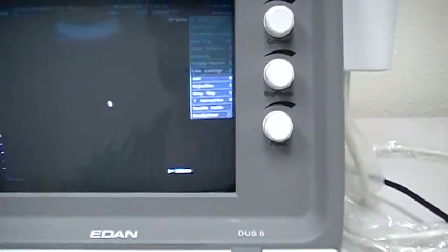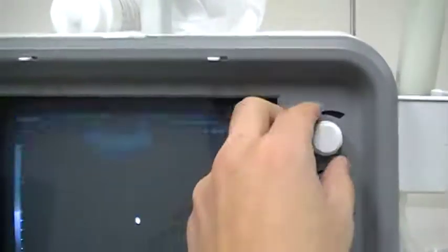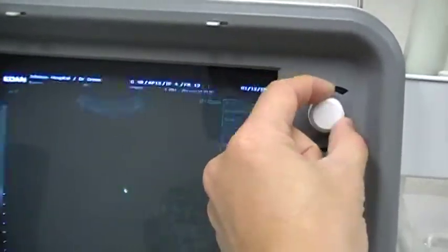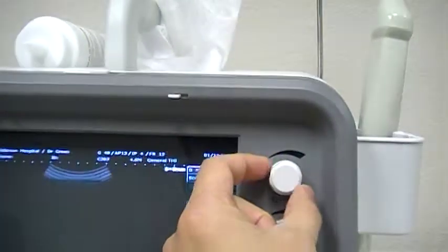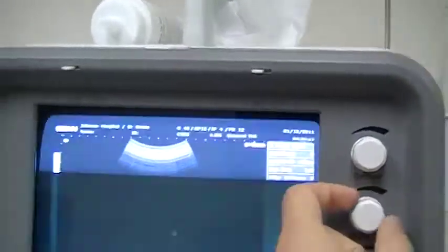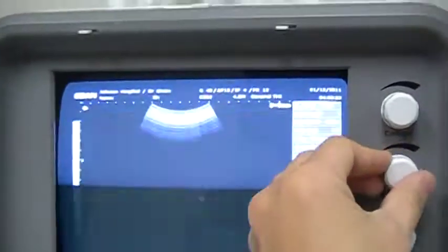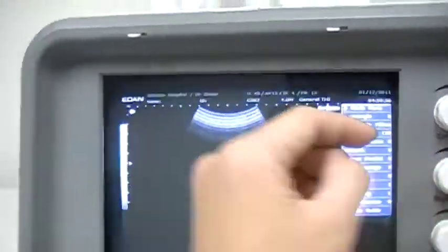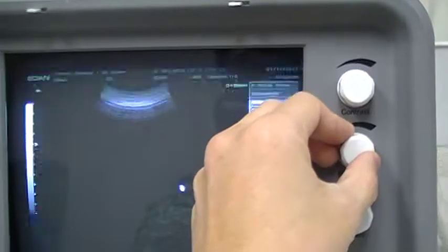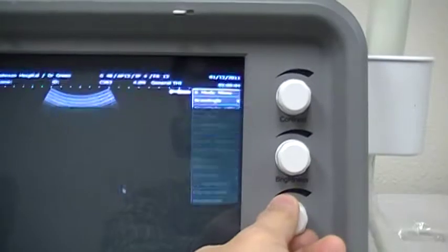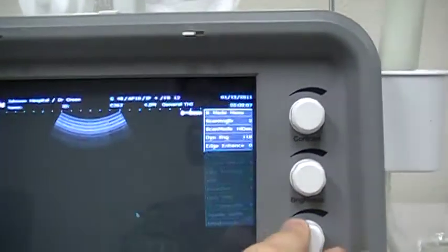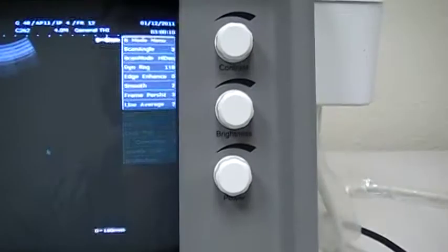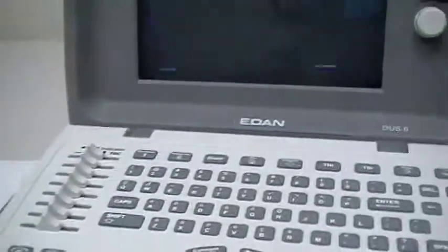Now we want to have a better image from this machine, so we need to adjust the contrast of the monitor. This is the way to adjust the contrast and the brightness. If you make it too bright the background becomes a little white; adjust it — if it is a little bit dark you can adjust it to get a better image. Also set the acoustic power to 10 or 11.